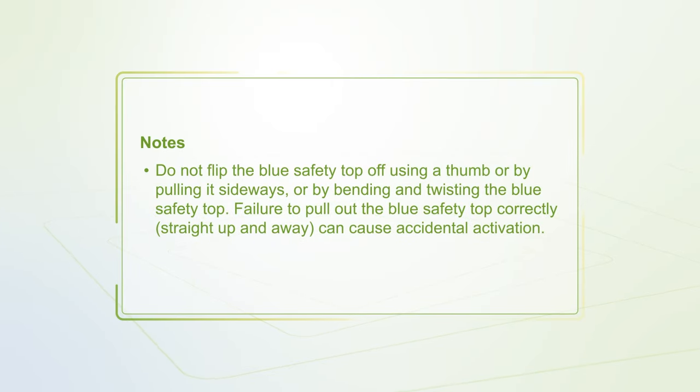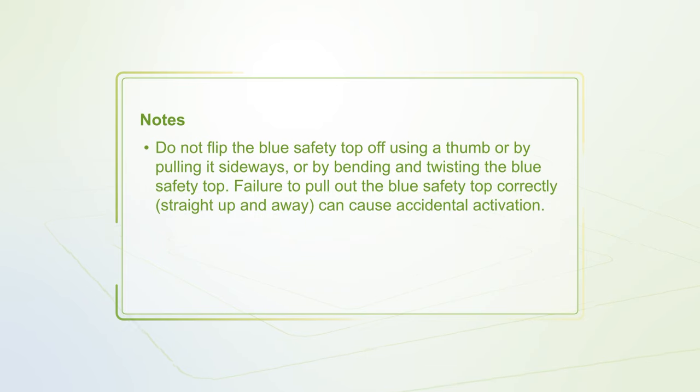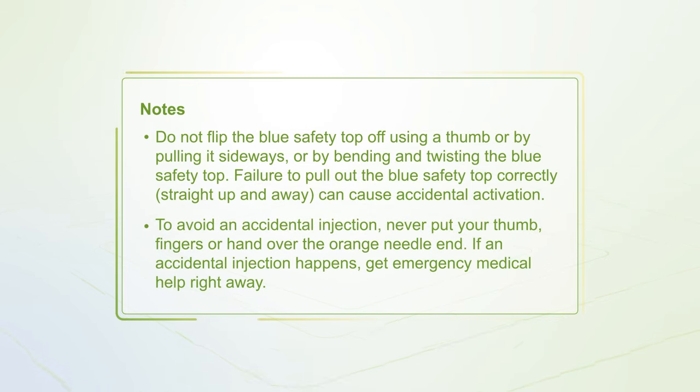Do not flip the blue safety top off using a thumb, or by pulling it sideways, or by bending and twisting it. Failure to pull the blue safety top straight up and away can cause accidental activation. To avoid an accidental injection, never put your thumb, fingers, or hand over the orange needle end. If an accidental injection happens, get emergency medical help right away.